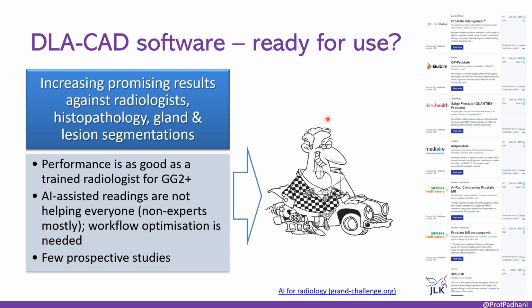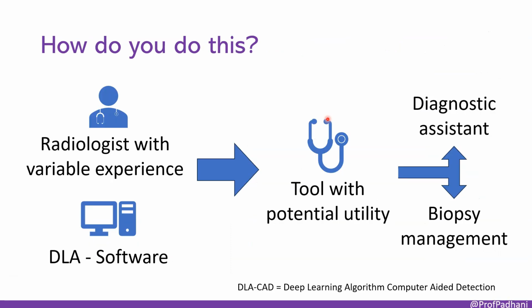As you can see from the AI for Radiology Grand Challenge website, numerous CE-marked and FDA-cleared tools are now available, but importantly, none of these have been comprehensively validated in prospective clinical studies in terms of improving diagnostic accuracy or workflow efficiency. So, conceptually, how do we integrate these tools? We have the radiologist, often with variable experience levels, and the DLA-CAD software.